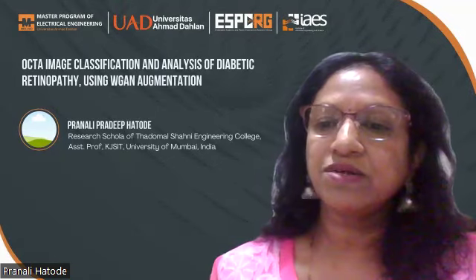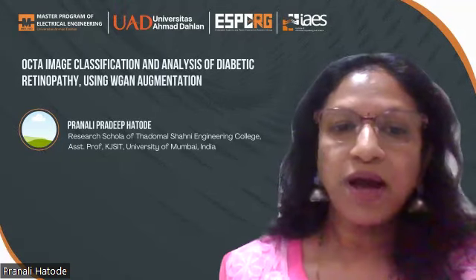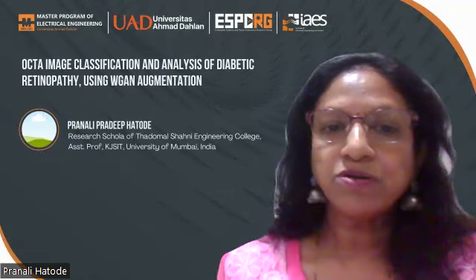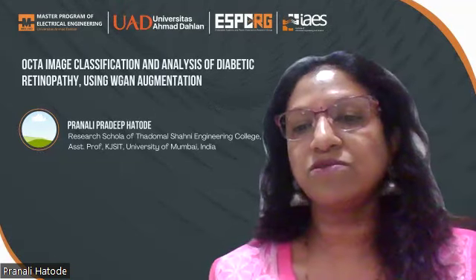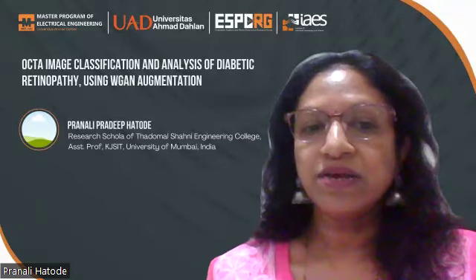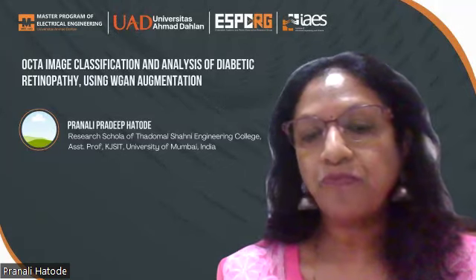Then the entire data set is zipped and downloaded. Now, why was the PNG format chosen? Because from the research and study, I came to know that ResNet 50 works best on the PNG image format.